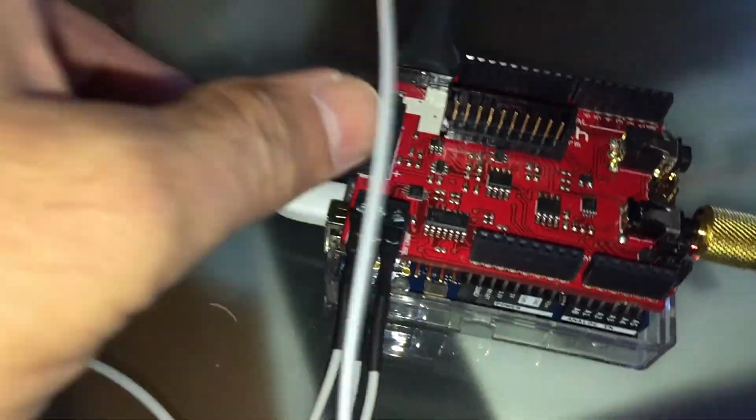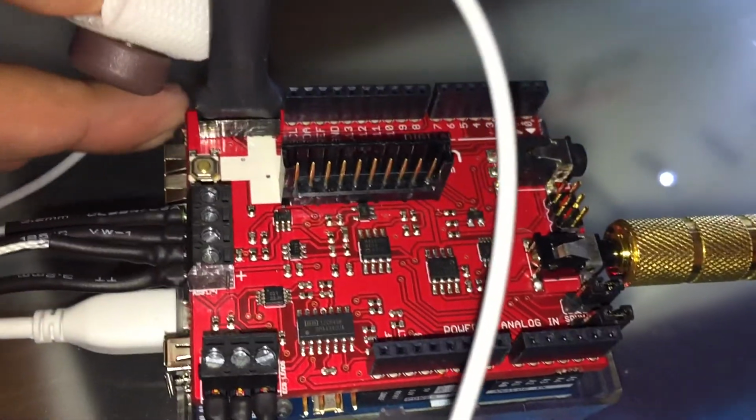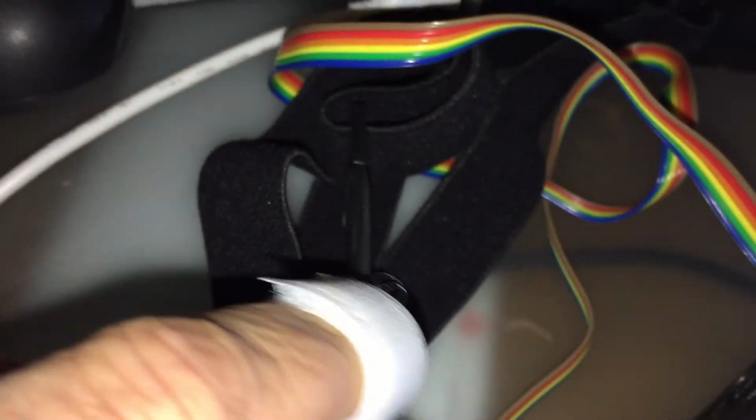What I have here is, as you can see, I've connected the Arduino. Oops. Obviously, I managed to disconnect it, but that's okay. We can reset it. That's the Arduino with the eHealth Shield. Multiple sensors connected. You've got the body position sensor. You've got the temperature sensor here.